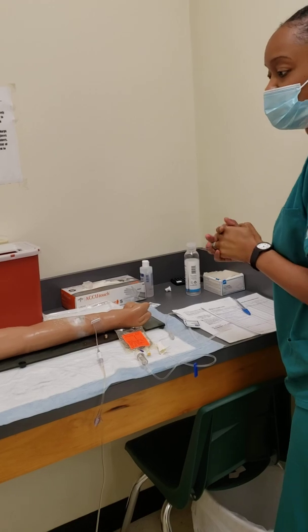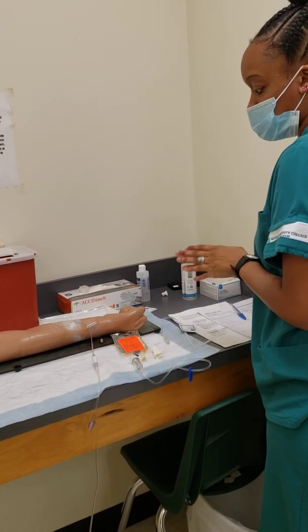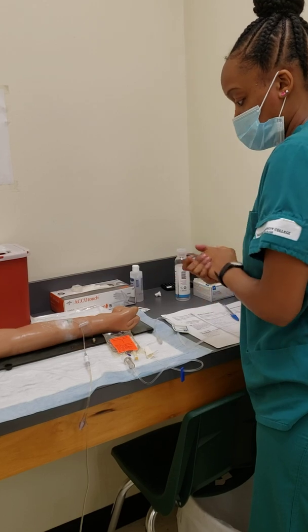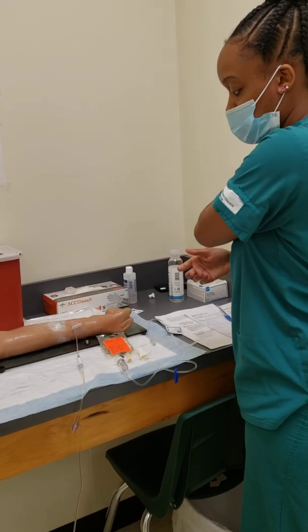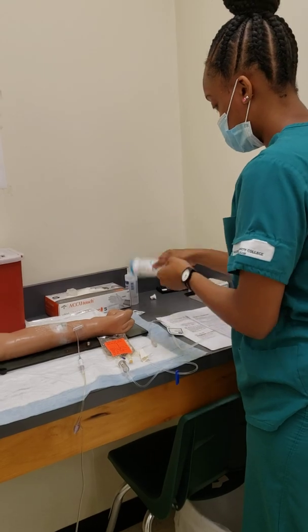I'm going to be giving you gentamicin, and this is an antibiotic to help with any infection that you have. So we're going to make sure we monitor your labs and everything, your CBC, white blood cell count, your liver functions and everything. And at any point in time you start having any burning, itchiness, or shortness of breath, please let me know, okay? All right, so I'm going to go ahead and perform hand hygiene.